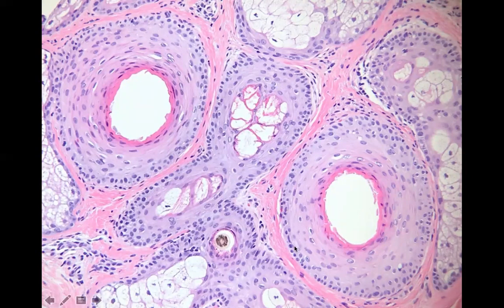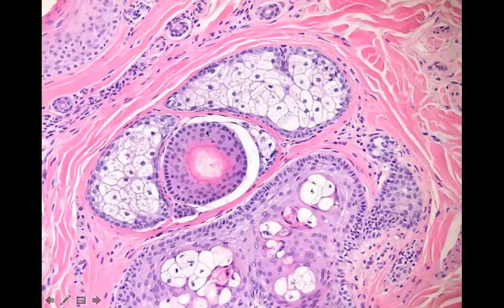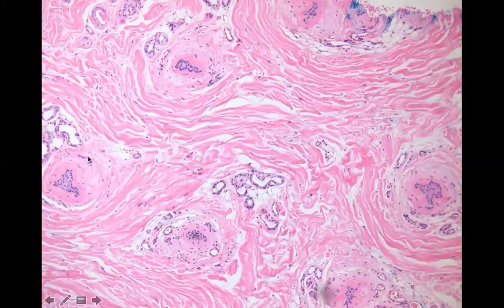So as a review, these are anagen. These are round and there's no necrotic epithelial cells in the follicle. This is what catagen looks like. The first phase starts with these apoptotic keratinocytes or epithelial cells in the follicle. So as soon as you start seeing that, you're hitting catagen. Then what happens is they start to shrivel and the inner section starts to become flamey looking. So as you get smaller and smaller, you're going to start to see the flame further along into telogen until it's completely like this little squiggly little section inside of this fibrous little column here. This is a full telogen.